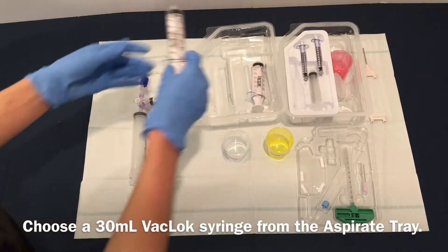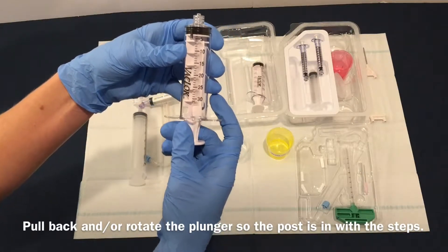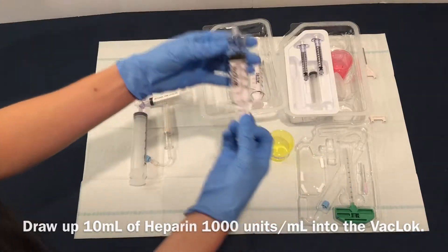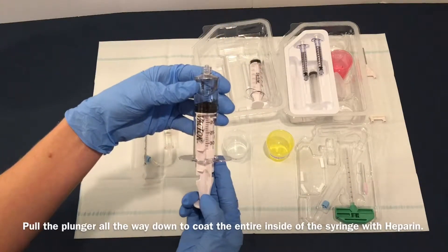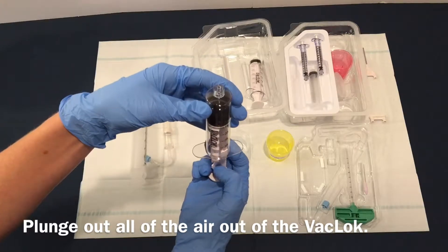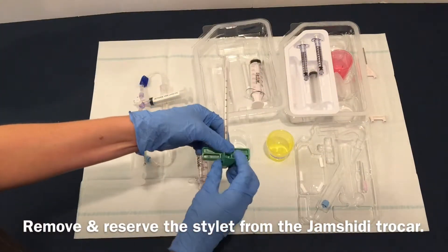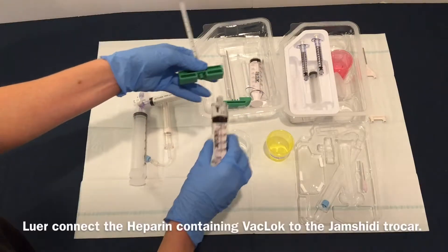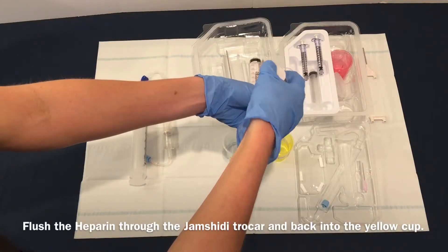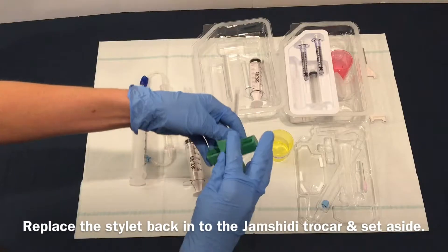Choose a 30 mL backlock syringe from the aspirate tray. Pull back and/or rotate the plunger so the post is in with the steps. Draw up 10 mL of heparin 1000 units per mL into the backlock. Pull the plunger all the way down to coat the entire inside of the syringe with heparin. Plunge all of the air out of the backlock. Remove and reserve the stylet from the Jamshidi Trocar. Luer connect the heparin-containing vaclock to the Jamshidi Trocar. Flush the heparin through the Jamshidi Trocar and back into the yellow cup.